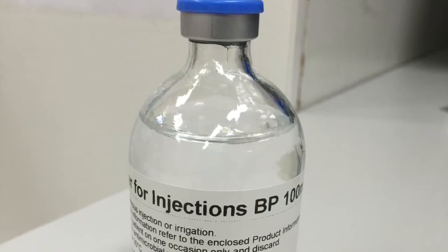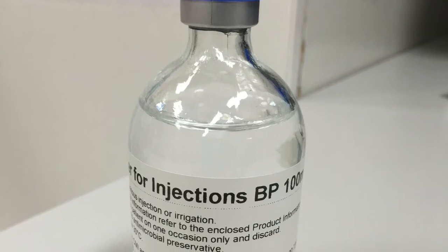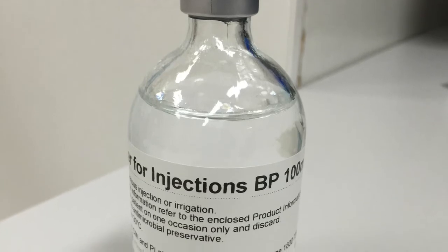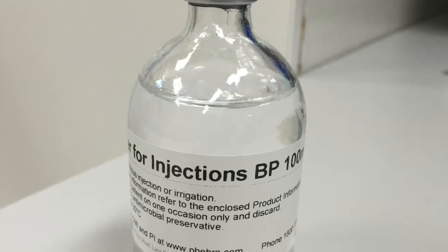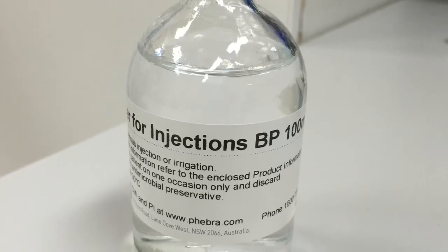The powdered Fibrinogen Concentrate contained in each ampule needs to be dissolved in 50ml of sterile water. Fibrinogen Concentrate is relatively slow to dissolve and does have a tendency to form a frothy foam if shaken or mixed too vigorously.